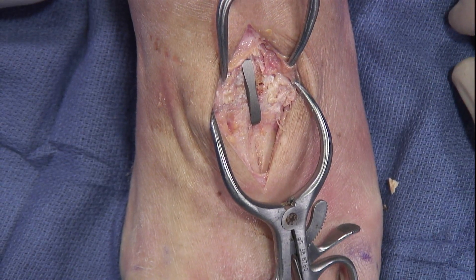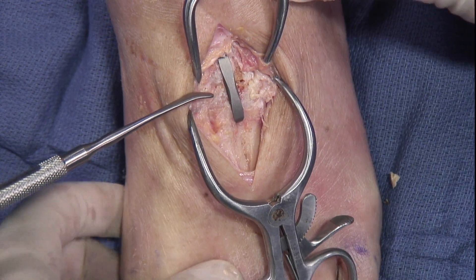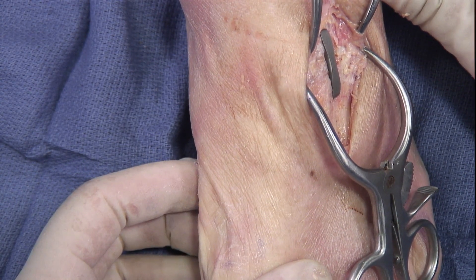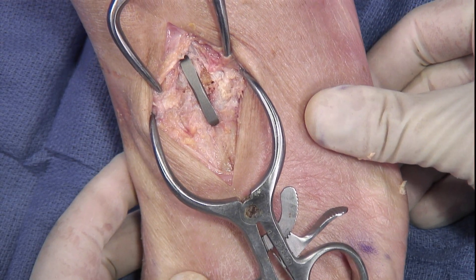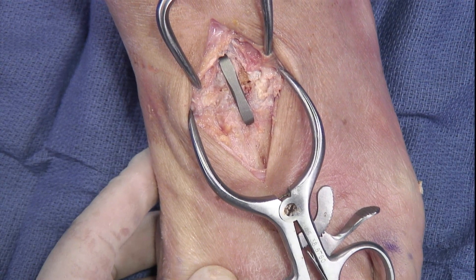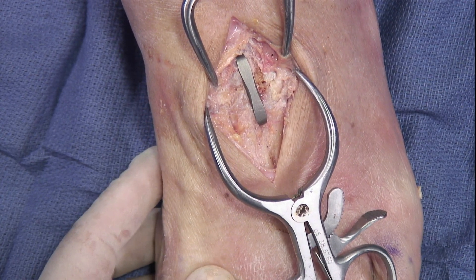Here we can see the staple in place after it's been gently impacted. There's a 25 millimeter staple — you can see how flush it is in the bone when we rotate the foot a little bit. It has a nice fit with a little bit of contour in the center. The joint that you could see before is now impossible to see — it's already getting constant compression across that area, and that's with doing a generous resection of the joint prior to placement of the staple. So it's low profile, but yet very strong.